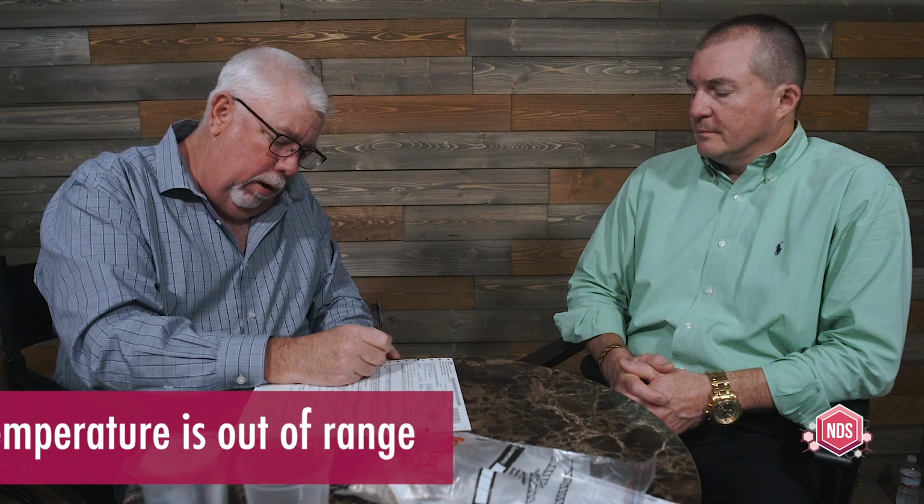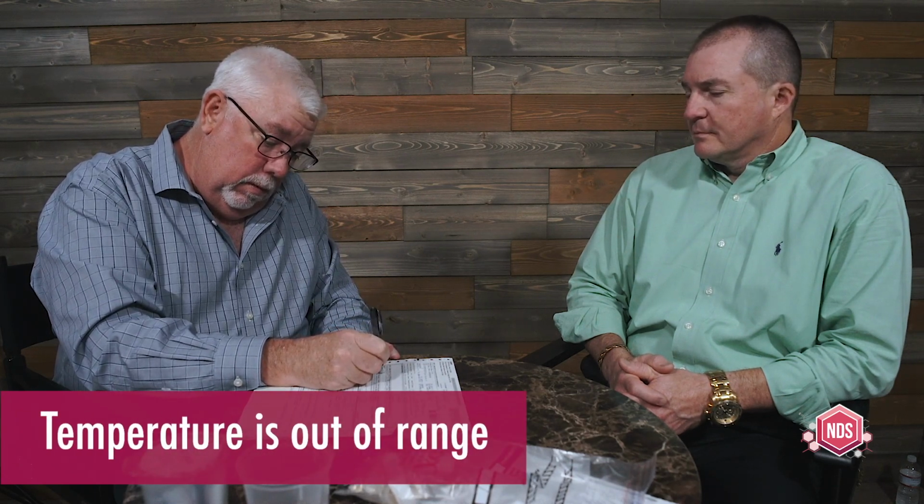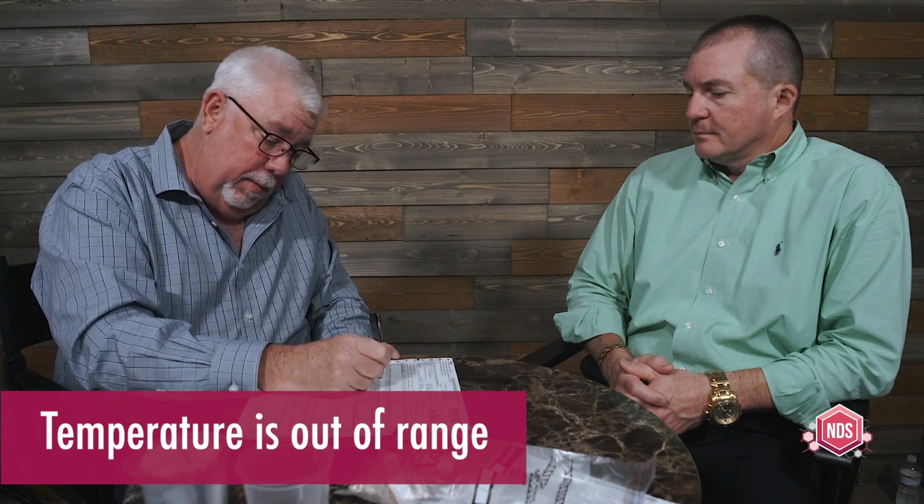So we have our two specimens. This is what we call specimen 1 of 2. I'm going to go ahead and put these in the bag so we have them kind of out of the way. We're going to finish off on our specimen collection form, our DOT federal drug testing custody and control form. Temperature was not in range. We do have a split collection. I'm going to put in the remarks temp out of range. And this is going to be specimen 1 of 2.